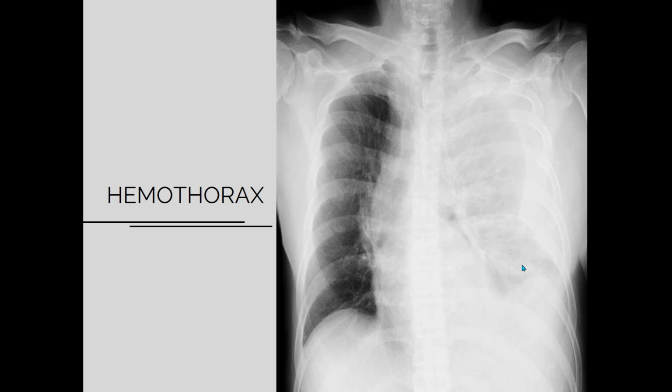Whenever we are talking about fluid in case of surgery, we keep in mind that this may be of trauma. Pleural effusions we are not giving you in the exam because that is covered in medicine. In surgery we are more concerned with trauma cases. So if you cannot see the lung fields and they are hazy or opacified, then you must think about blood.